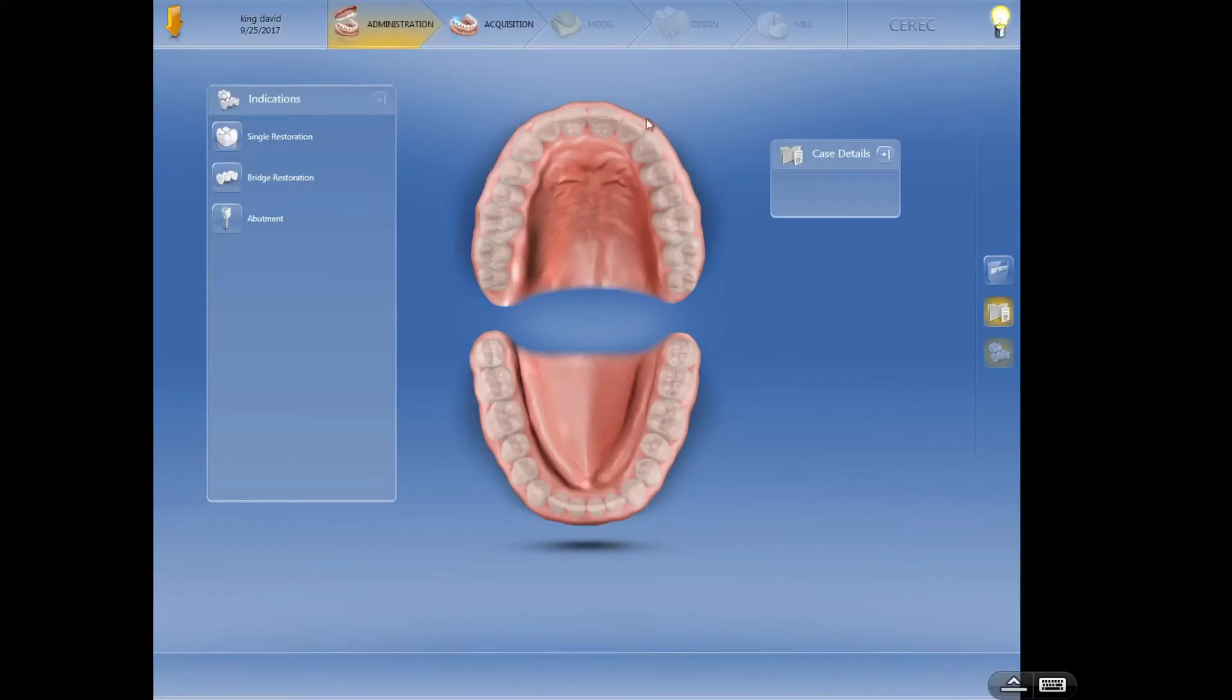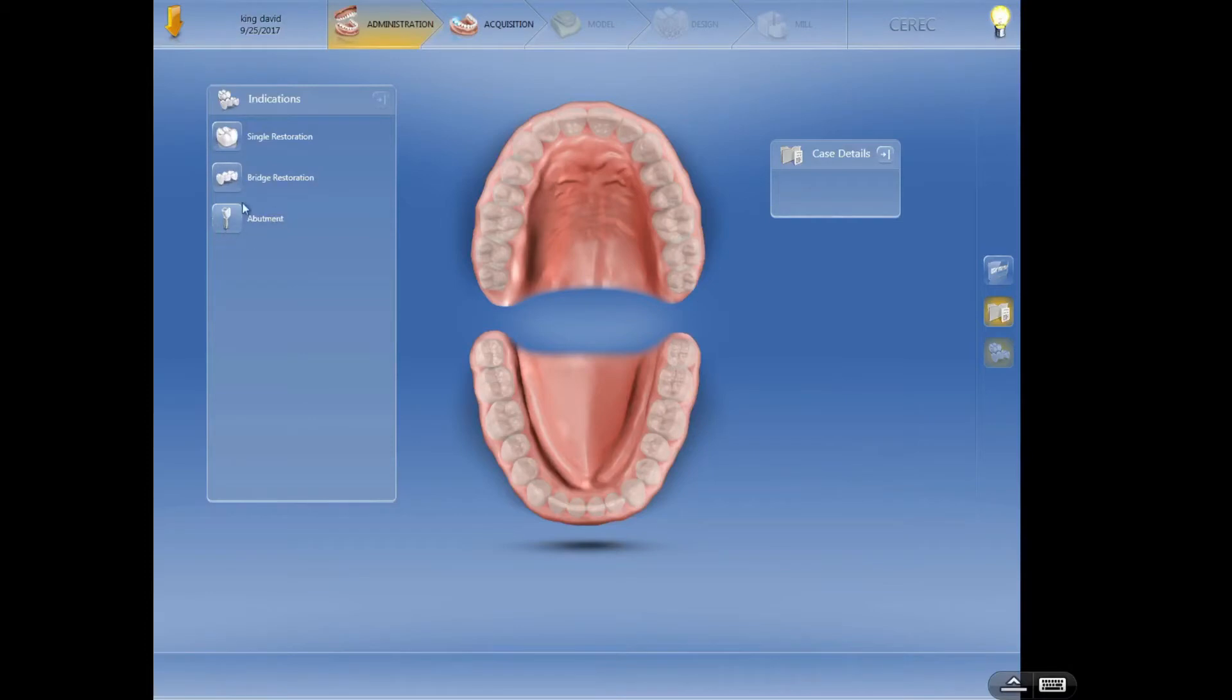So let's talk about this screen right here. This is the main screen for you to set up your case. Looking over here on the left side, we've got a single restoration, we've got a bridge restoration, and we've got an abutment.